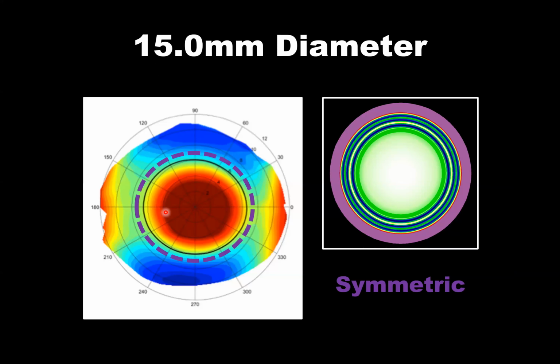So when we look at corneal scleral topography or OCT study of the eye shape beyond the cornea, it's well understood that the closer you land a scleral lens to the borders of the visible iris, the less asymmetric the eye is. In other words, the closer we are to the limbus, the more likely we are to need a symmetric landing scleral lens. So your small 15.0 diameter is a symmetric alignment zone or symmetric landing.